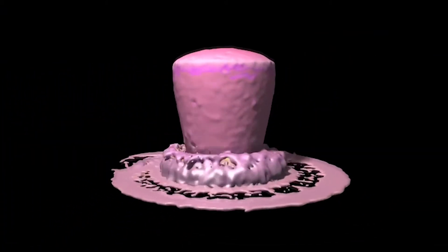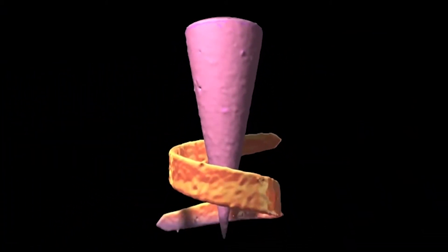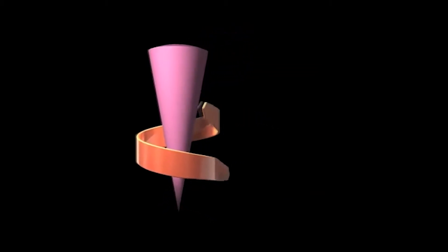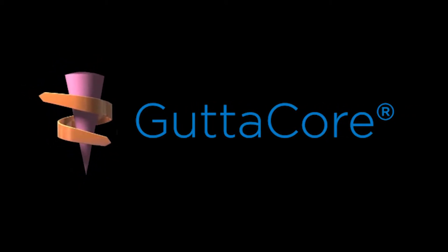What if there was a way to turn warm, flowable Guttapercha into an easy-to-remove obturator core? Cross-linking technology makes it possible. Introducing GuttaCore Obturators, because it's what's inside that counts.